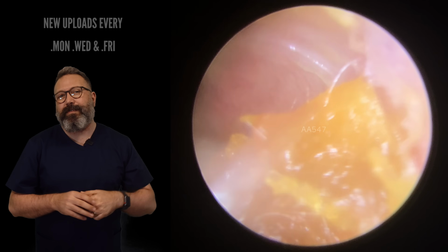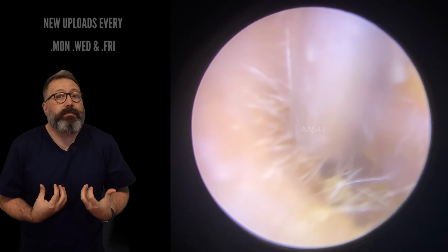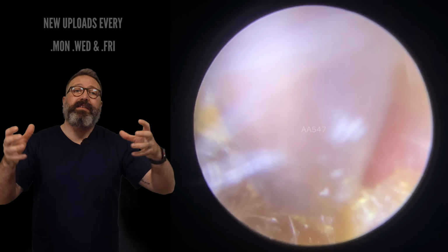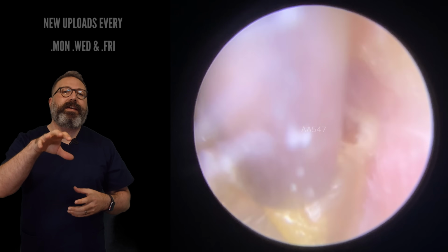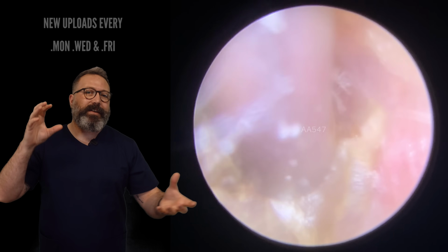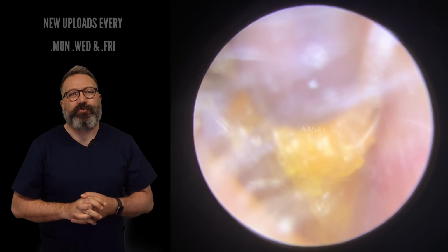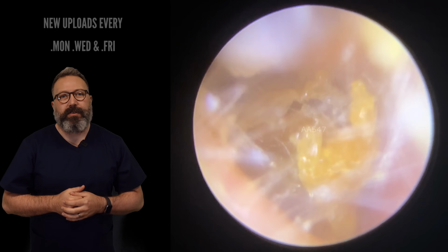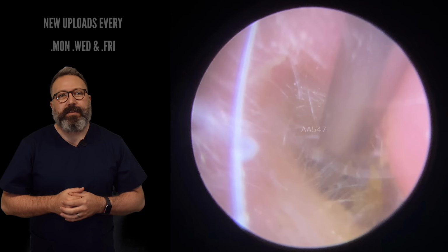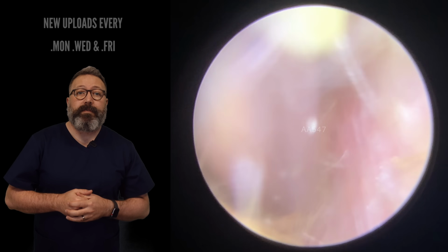And then, what you always find, or personally what I always find with these particular types, is when you get this kind of skin collapsing down, a lot of the time you'll get this really sticky piece of wax that's sitting just behind it all, that's gone trapped there and dried out and become really, really sticky and tacky. And that's what's going on here. So you can, oh, just got a little bit stuck in the end of the suction tube there. So we're just going to go back in and get this last little bit out.